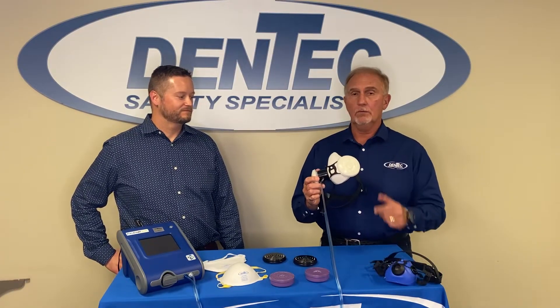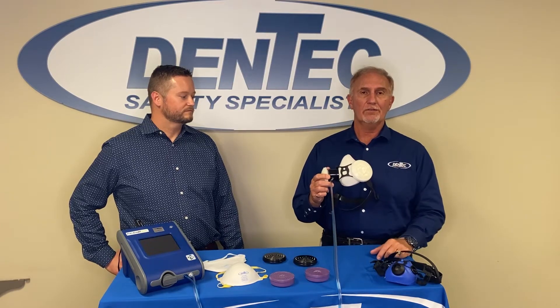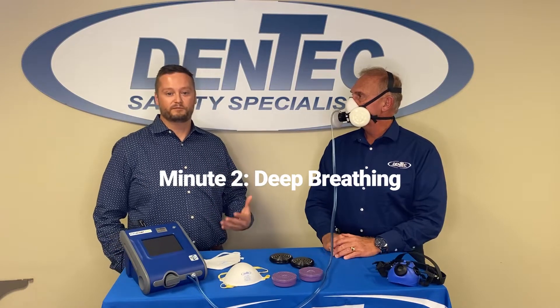We're going to explain very quickly the different exercises that you're supposed to conduct when doing quantitative fit testing. Understand folks — I have a goatee and you're not to have any facial hair when wearing any type of respiratory protection — but for the purpose of this exercise, I'm going to put the mask on and show you the different exercises. For minute one, just normal breathing. Minute two is deep breathing.